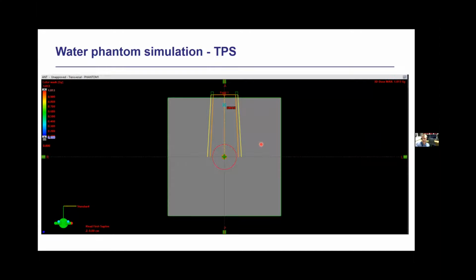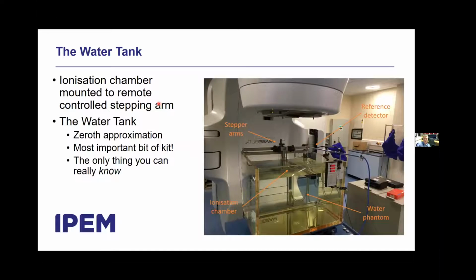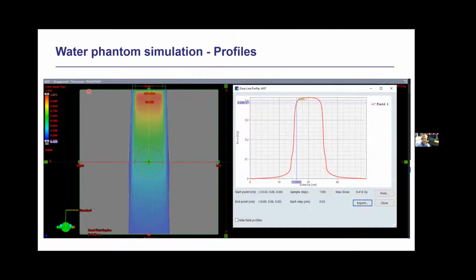Remember I said that a patient has a CT scan. We need a model that lets us calculate the dose within the patient absorber volume. And this allows us to compare calculations. So here we've got calculations of percentage depth dose with measurements. We can measure a percentage depth dose and we can calculate a percentage depth dose. And when we compare the two, we are exactly doing physics, all right? We have measurements and we have calculations and we appraise the two with respect to each other. And if we've done our job properly, we'll have what we know as a beam model.